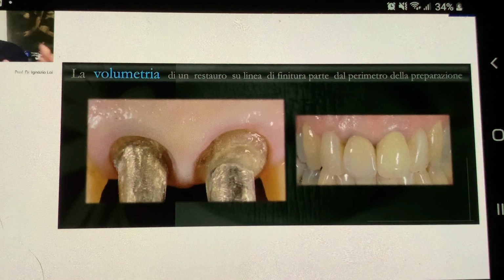So what treatment can we have here? And this is when we start to talk about BOPT. What are the treatments that we can use, for example, in clinical cases like this? These are cases which are usually treated through surgery. So treating the lower part to be able to realign it towards the higher part. And it is difficult with this technique lowering the tissues towards the coronal part. And so this causes exactly what I said before.